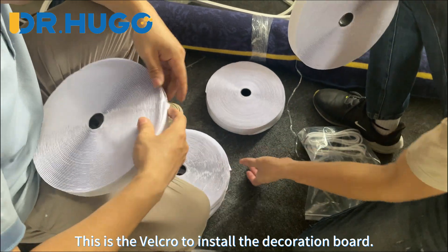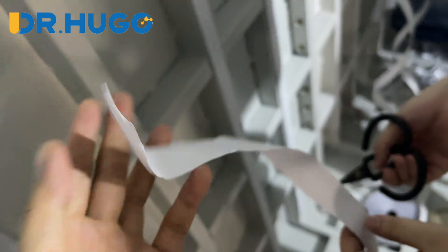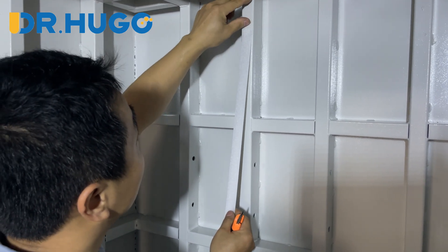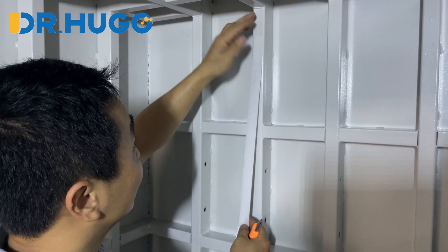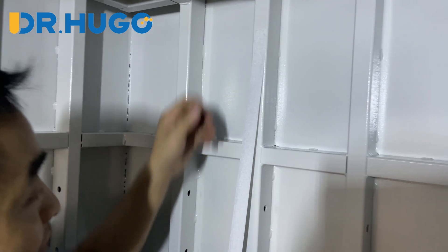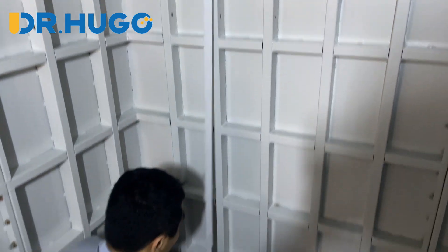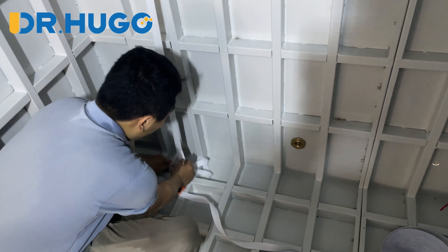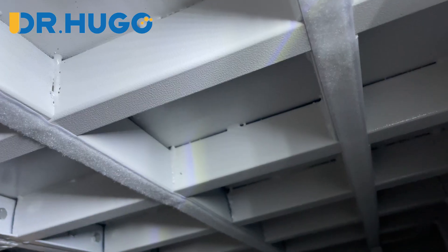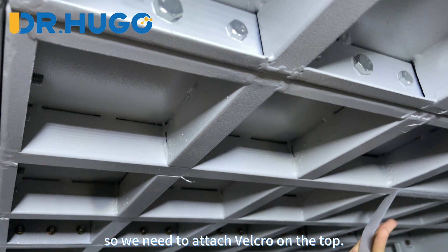This is the velcro to install the decoration board. Let's attach the base part of the velcro. Please leave about 5 cm distance to the top. The bottom also leaves the same 5 cm distance. The chamber top also needs the decoration board installed, so we need to attach velcro on the top.